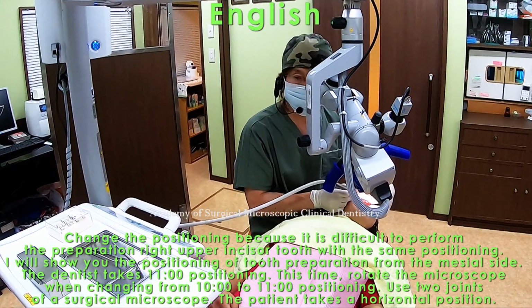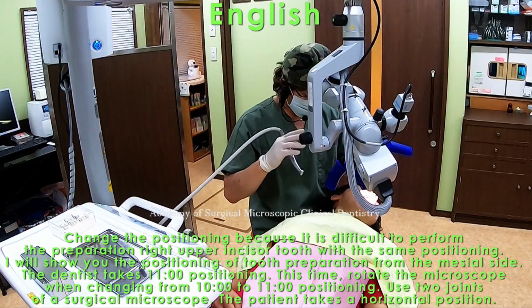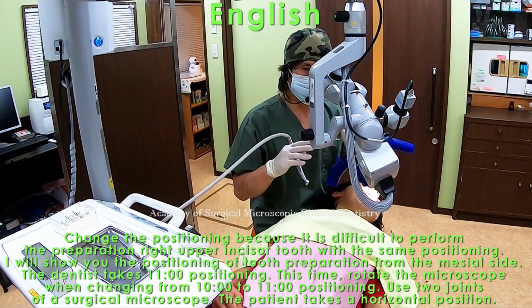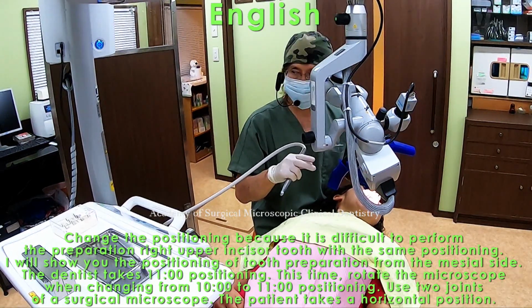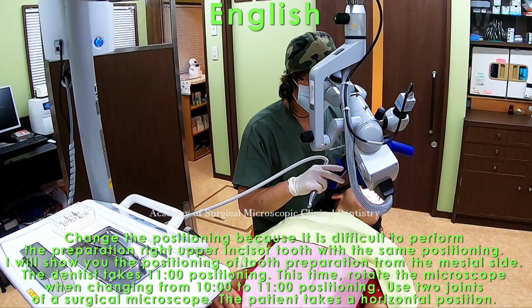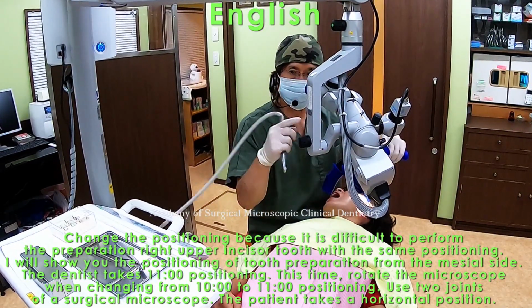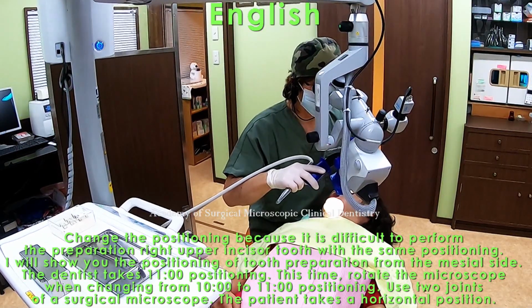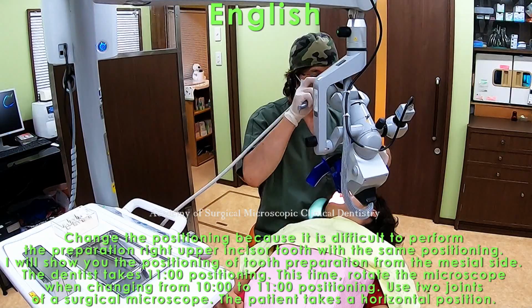Change the positioning because it is difficult to perform the preparation of the right upper incisor from the same position. With the same positioning, I will show you the positioning of tooth preparation from the mesial side. Dentist takes 11 o'clock positioning. This time, rotate the microscope when changing from 10 o'clock to 11 o'clock positioning. Use two joints of a surgical microscope.